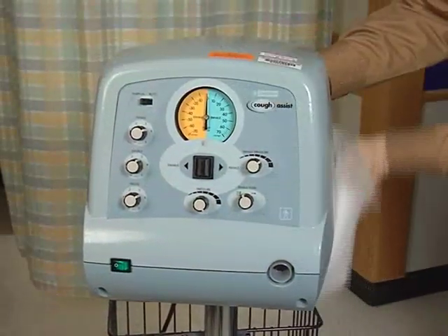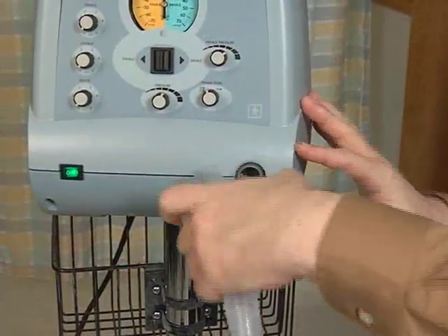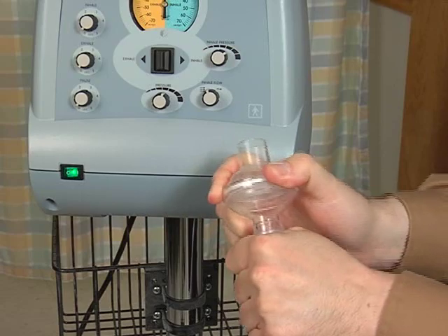Clean the outside of the unit with 70 percent isopropyl alcohol. The filter should be changed once every three months. However, it should be changed if soiled with secretions or water.